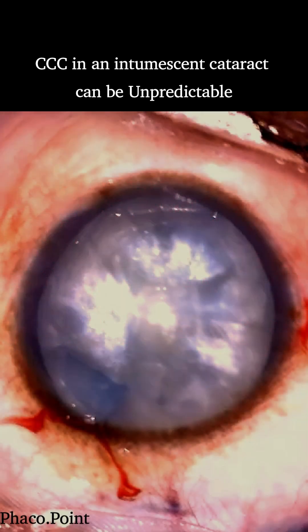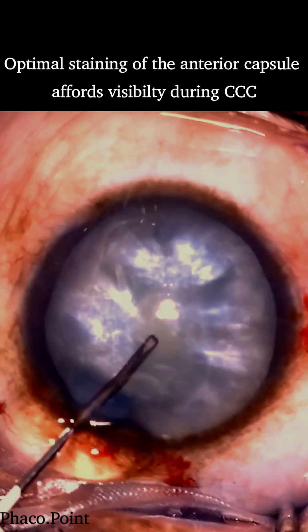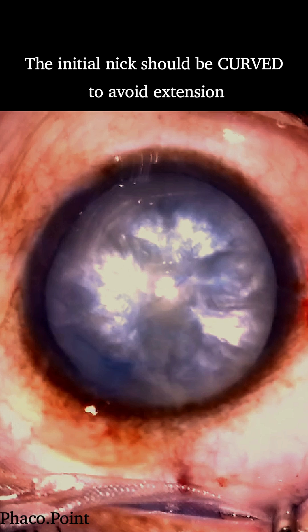Here's a simple technique to perform a spiral rhexis. After adequately staining the anterior capsule and deepening the anterior chamber with a cohesive viscoelastic, a meticulously created cystitome is introduced and makes an initial nick in the central anterior capsule.